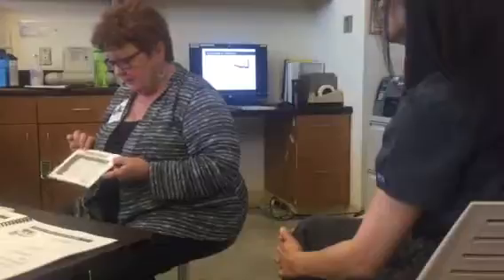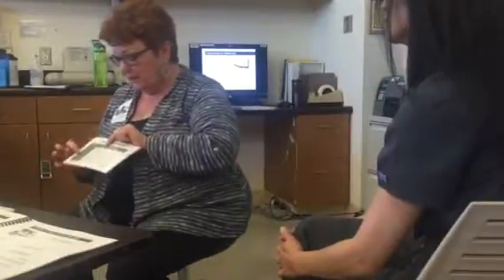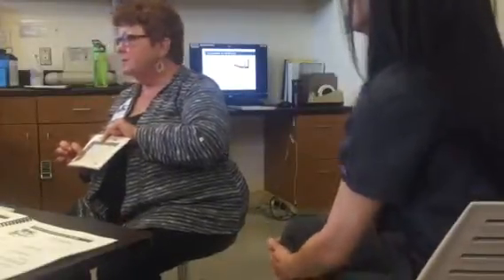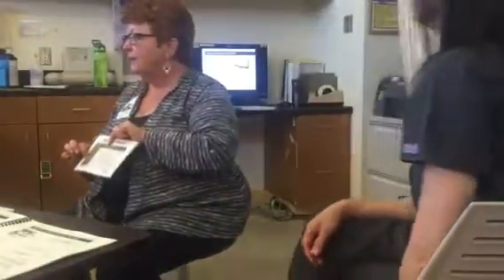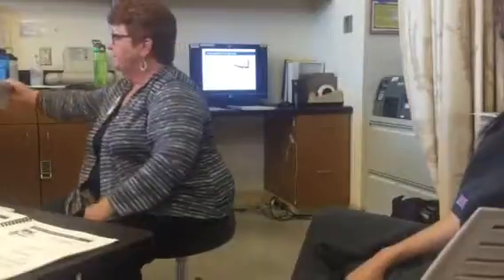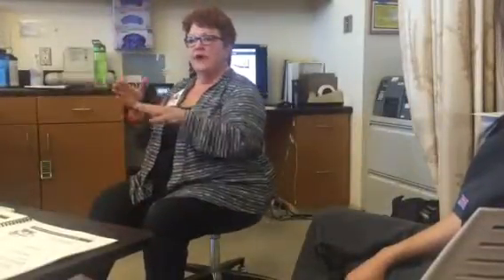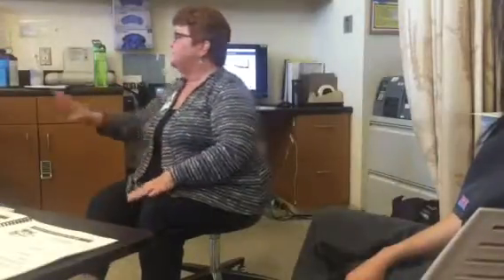And it says, for example, if you've got a patient who mobilized really well and they have an 80,000 white count, and the inlet pump today, you're able to get up to 60 or 70 mils a minute, what would you do potentially with the collect pump flow rate? Increase it to 1.2 or 1.3, depending on how fast you were running. Okay? It's just a chart. You do an x-axis and a y-axis and where they intersect. And that's only if you just have that. Right, that's it. And actually, no.